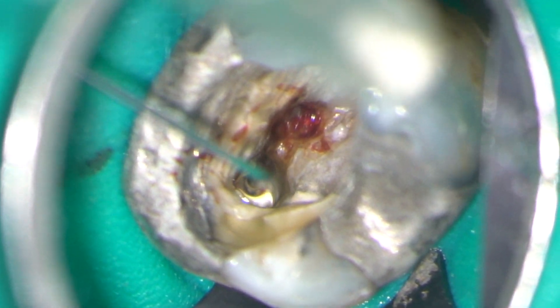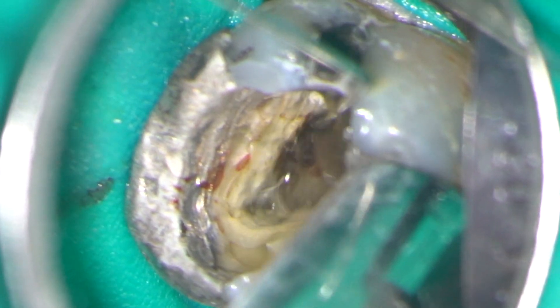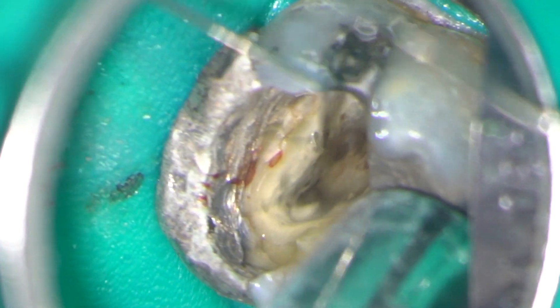I'm now rinsing out the access cavity with 3% sodium hypochlorite and as you'll see in a minute there's convergence between the MB canals.